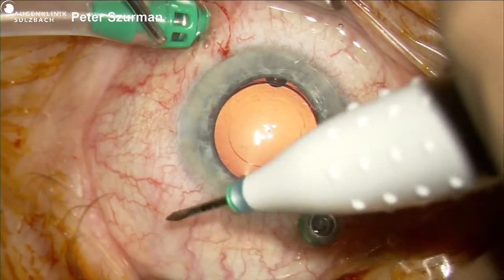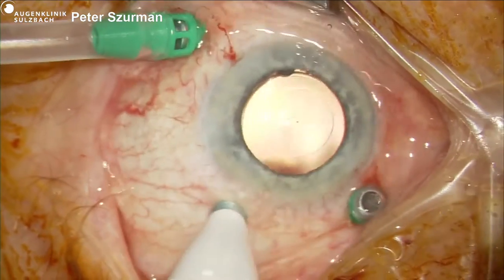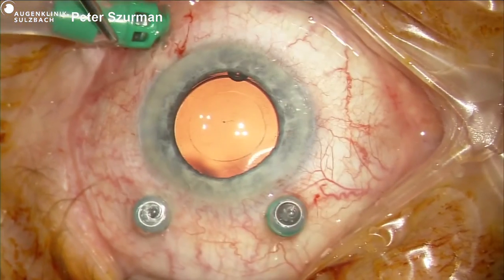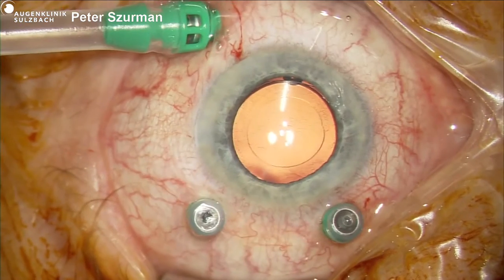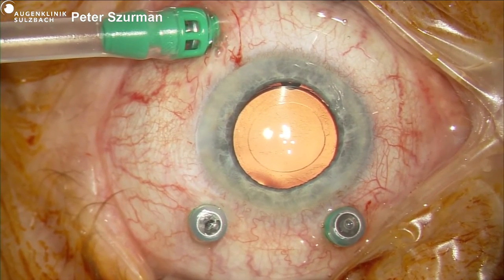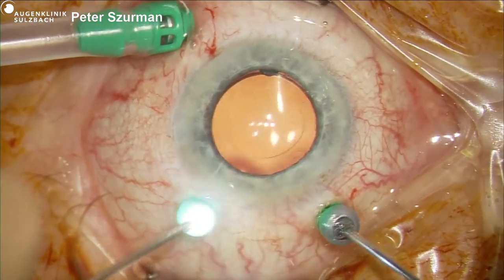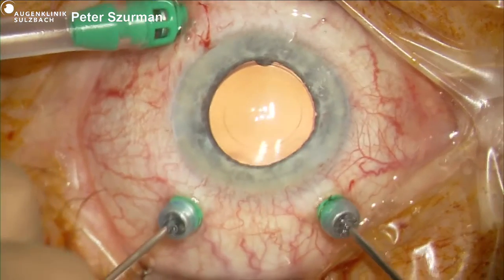You see that we use a slightly different technique, which we have published. It's a limbus parallel approach and not a radial approach. But this is just a minor detail. We have done the phaco before we're on broadcast. So the phaco is ready.